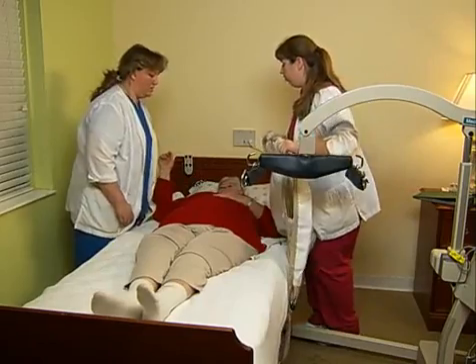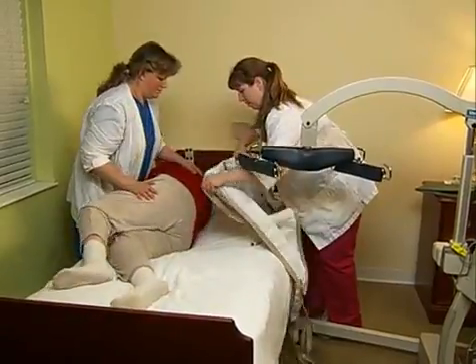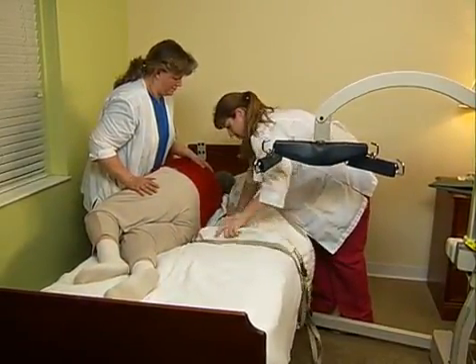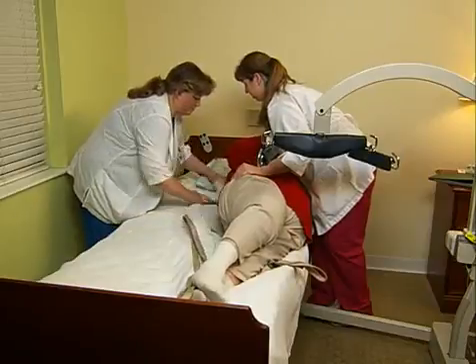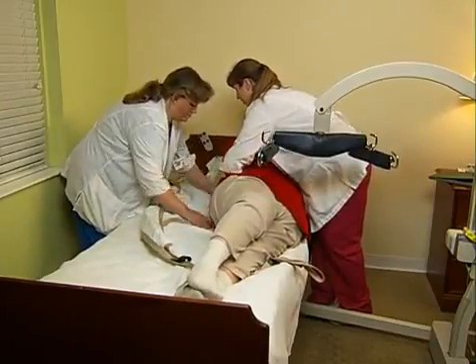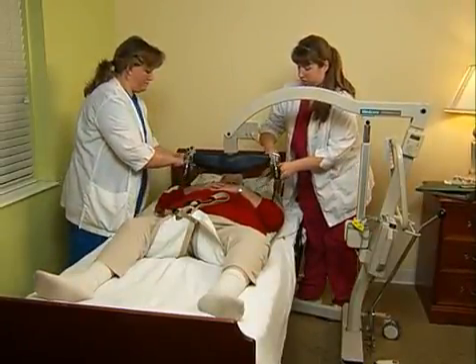Okay, Miss Jones, can I get you to roll towards Lori? Roll the patient onto one side. Place the sling under her, using good body mechanics and the help of an assistant if needed. Go back on the back. Attach the sling to the scale.